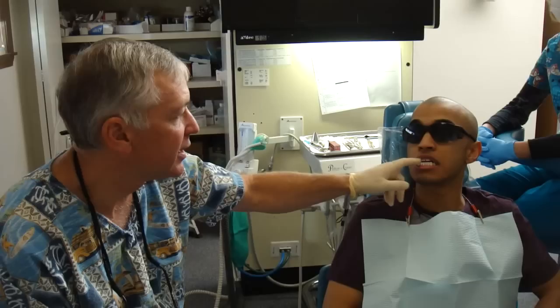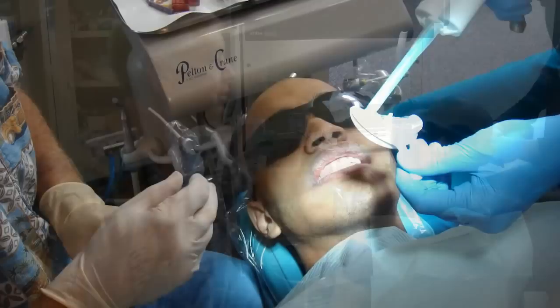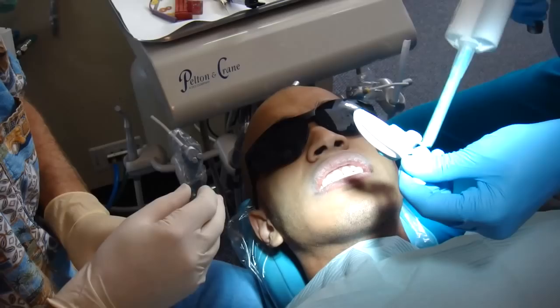All right, we'll get started on that. So we're taking a mold of Mo's teeth here and this will be what we make the veneers off of. Go ahead and open real wide.